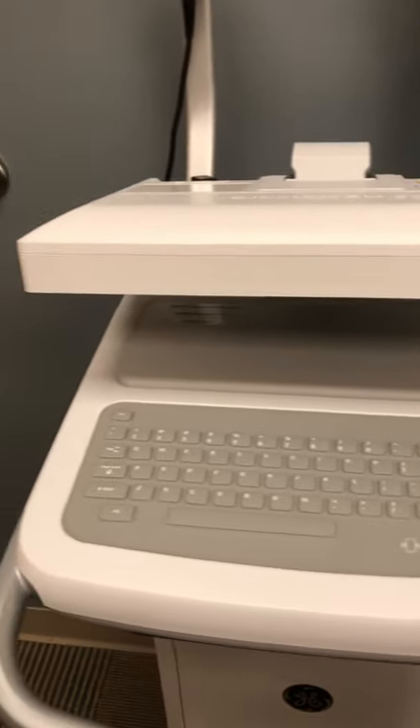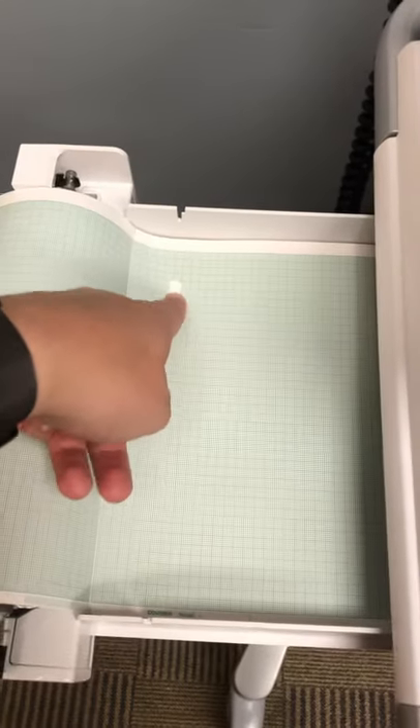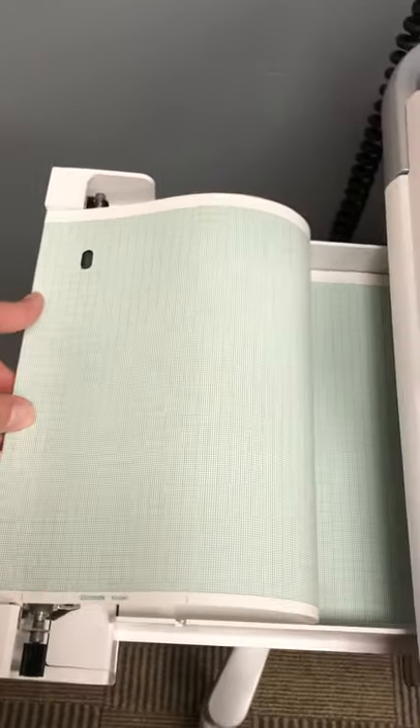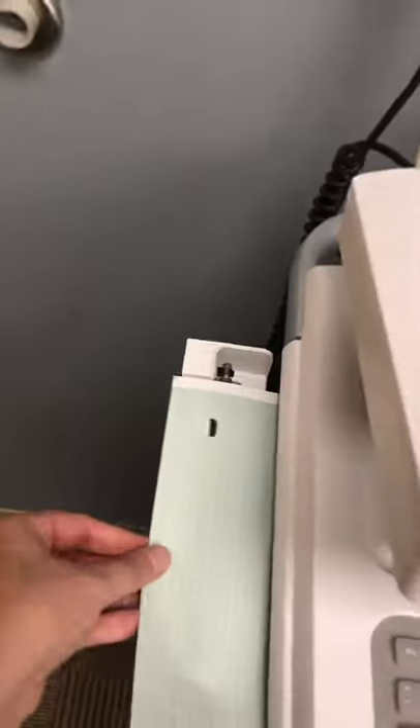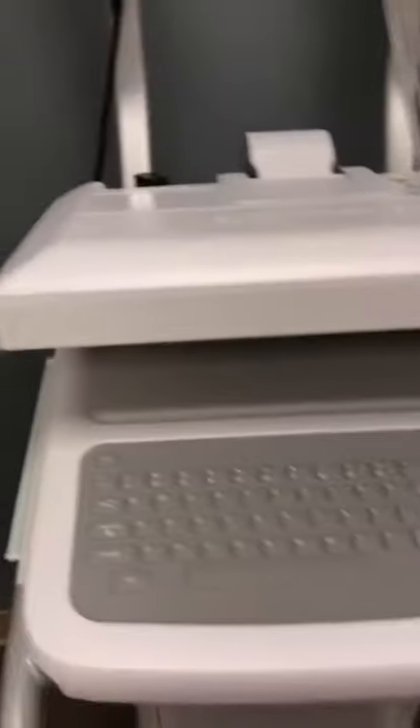One quick note about loading paper: there is a little release handle down here — pull it and it pulls the paper out. The paper must be inserted with the left hole or dot at the top left corner. Fold the paper over so it's face up, insert it, fold it over, and push it back in. It's okay if it's sticking out a little bit — the machine will pull it back in to print the EKG on one full piece of paper.